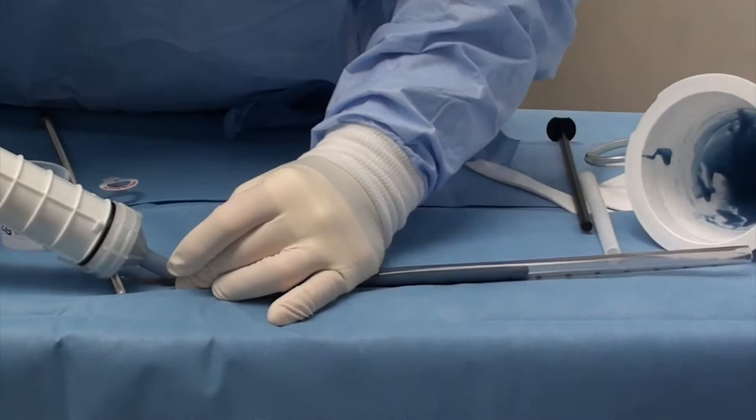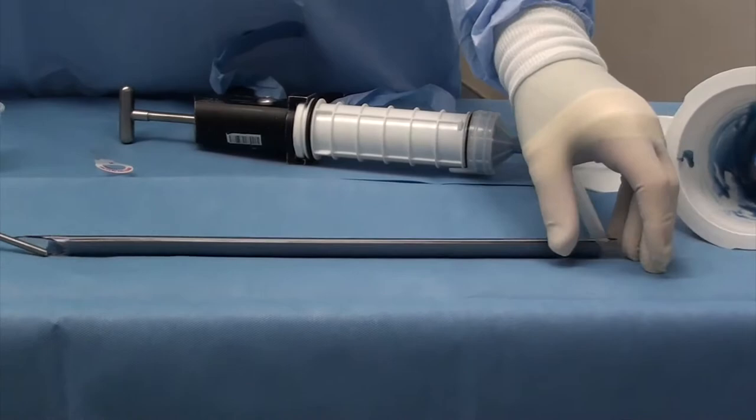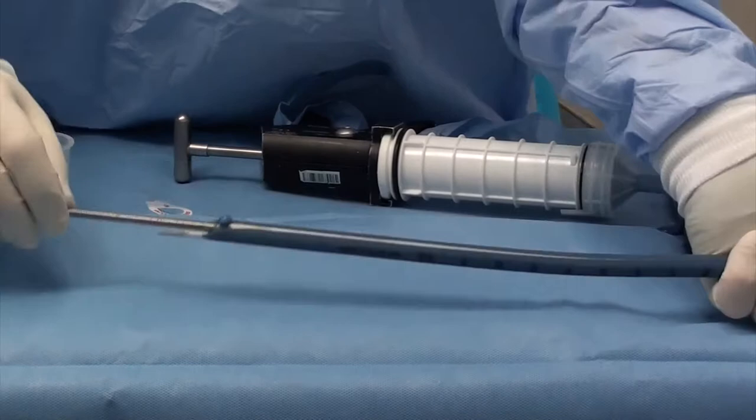Now we're going to go ahead and fill our chest tube with the antibiotic cement. The next step is to push the chest tube in — we're going to push it in from this end. On the far end we're going to keep our thumb over the edge to make it pressurize inside of the chest tube so that the nail stays coated with cement throughout.